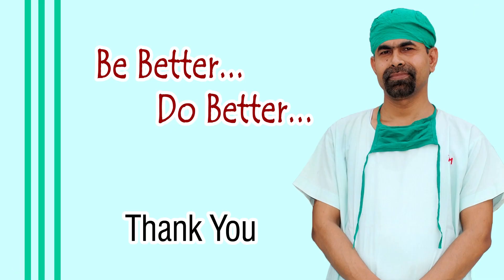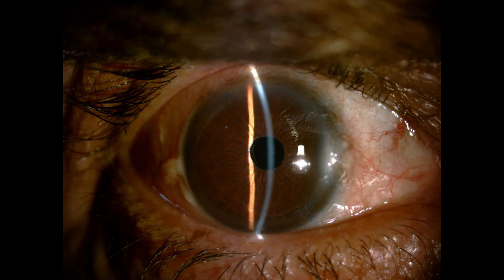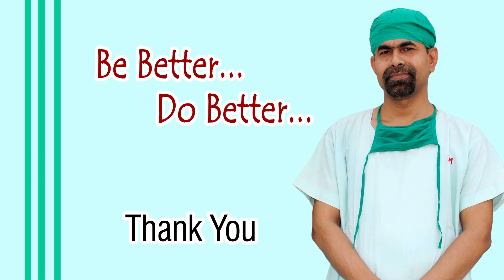Now let us see some post-op pictures taken 72 hours after surgery. Cornea is clear, anterior chamber is quiet, and the patient has an unaided vision of 6/12. Really a gratifying result. Thank you very much for your attention.